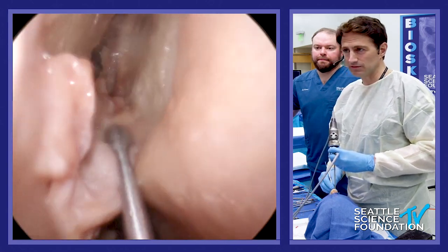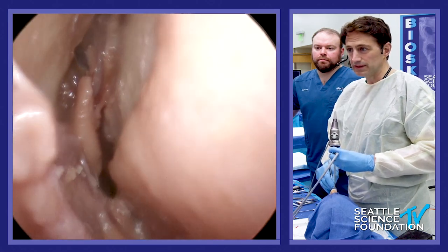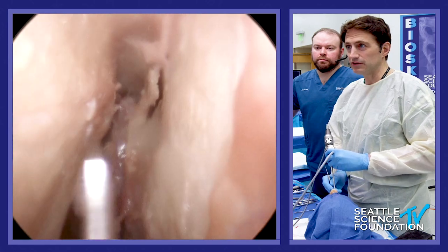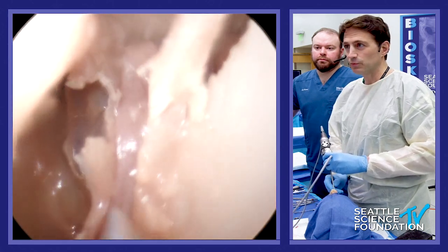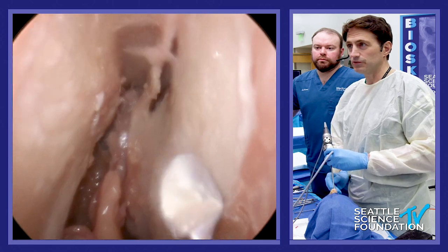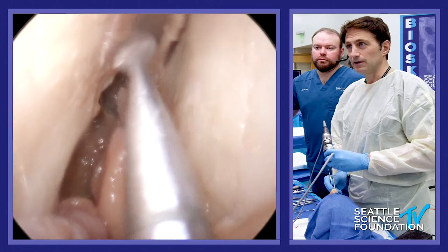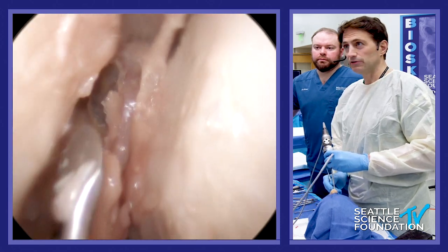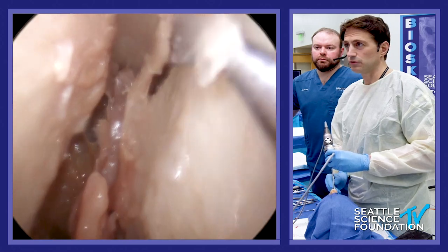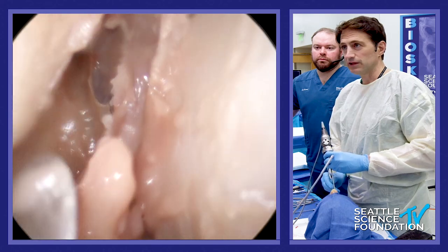So this is the flap, and the advantage of doing this flap is that you elevate it and put it down. What that does is it exposes all this bone and this pathway, using a zero-degree scope to be able to just drill this out incredibly quickly. You're going to thin out the nasal lacrimal area right here, you're going to take the frontal floor, you're going to take the upper septum, and the inner sinus septum up here eventually.